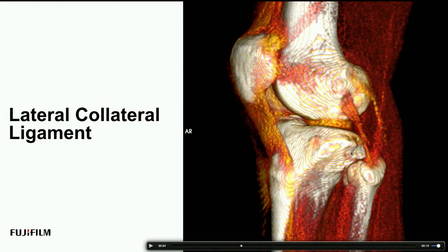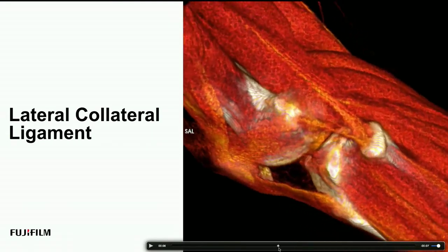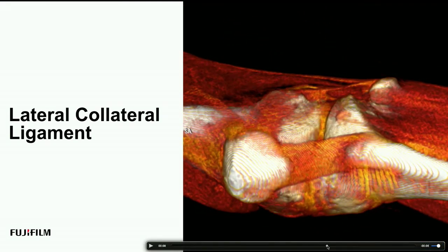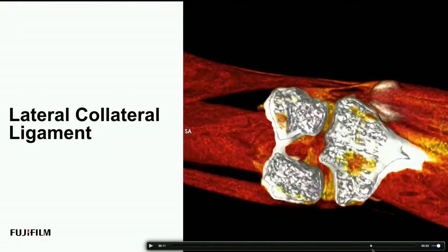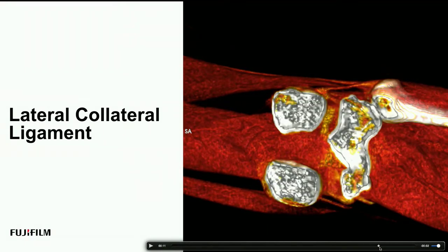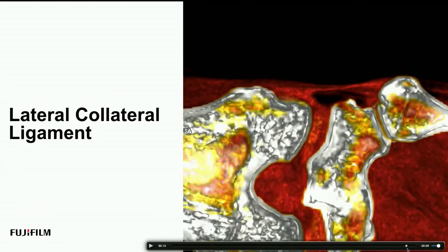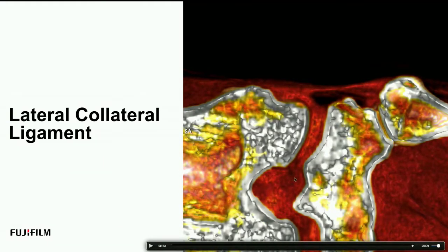Okay, now what we're going to do is rotate this 3D CT and let's cut the anatomy how it should look on the ultrasound. So let's remove a few layers here, and let's cut into the femur just because we can. Have a little bit of fun with our radiology depictions here. All right, so we're going to zoom in, and we should see this surface.